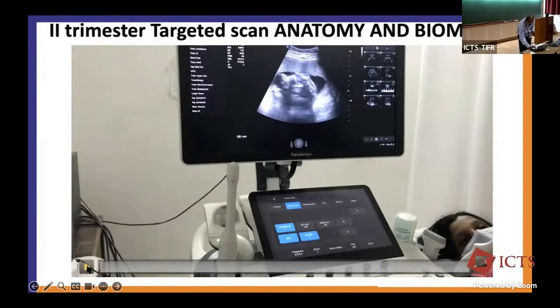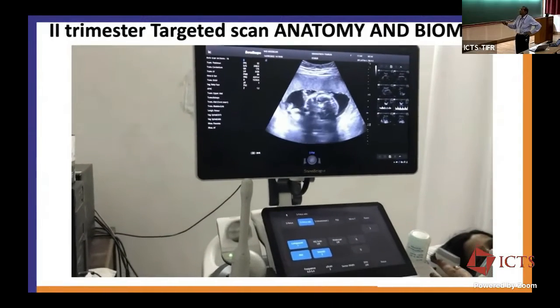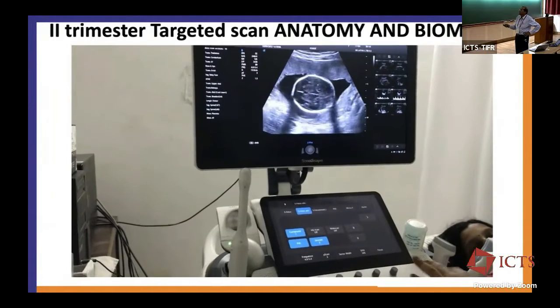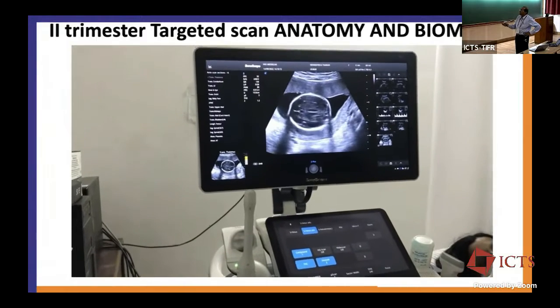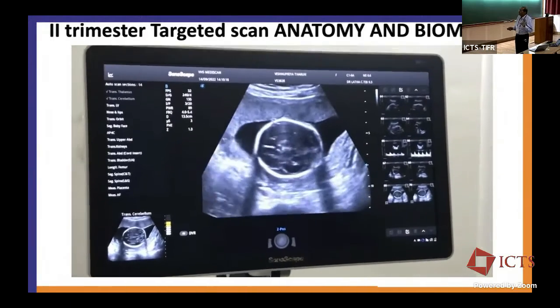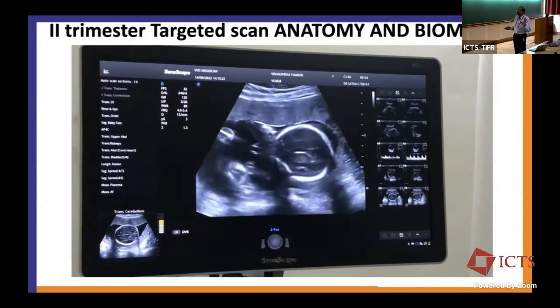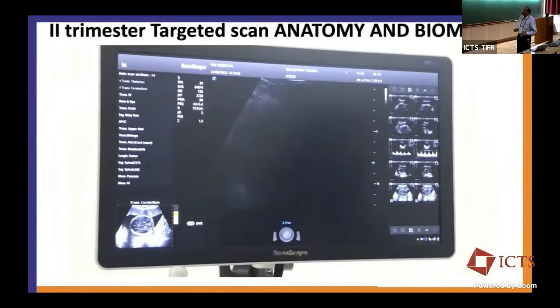So I just started doing the scan. This is a real patient whom we are doing. And here on this side, you're having this big list. If you see this image which is frozen here, I am not freezing them. It is automatically happening as I'm moving the probe. And every time I've done this, one of this will get checked out.